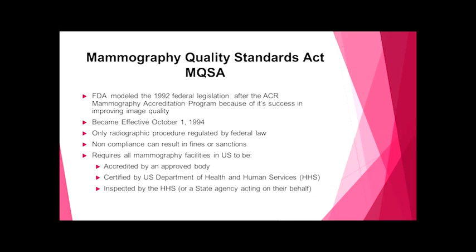If you're in the state of Texas, you have the ability to choose whether you're going to go with ACR accreditation or the Texas Mammography Accreditation Program. If you're in a state that isn't a recognized accreditation body, then your only choice would be through the ACR, the American College of Radiology.